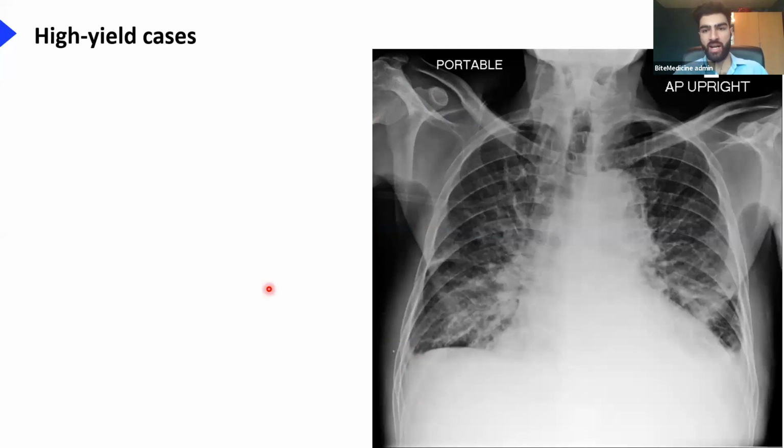It's on the slides. It's far too detailed for my liking, but you guys can go through that if you wish. Okay, aiming to finish in 10 minutes. Whatever we don't finish today, we'll go through in the next session, so don't worry. What's the diagnosis? Give me one unifying diagnosis here.